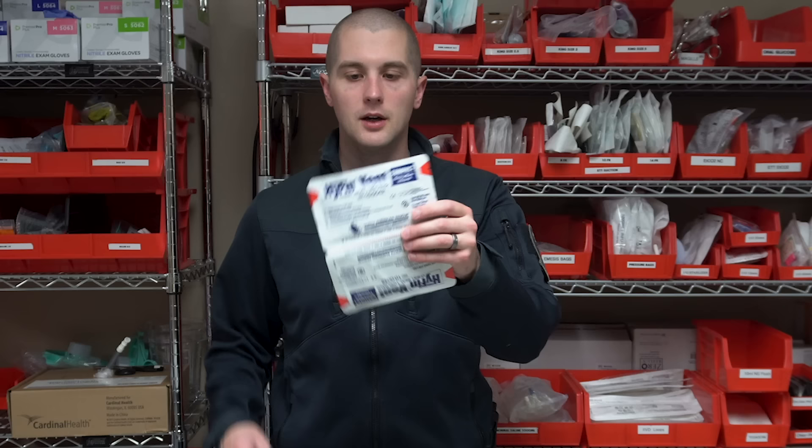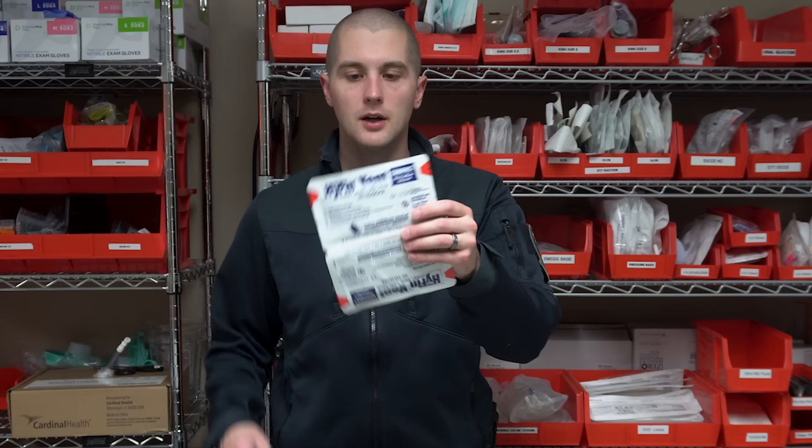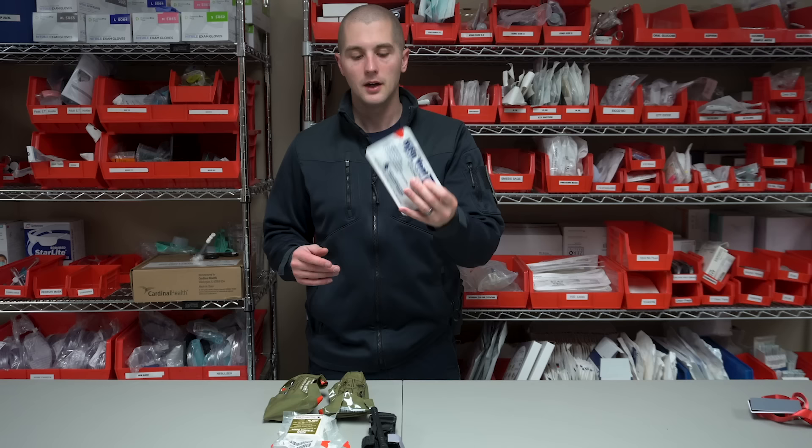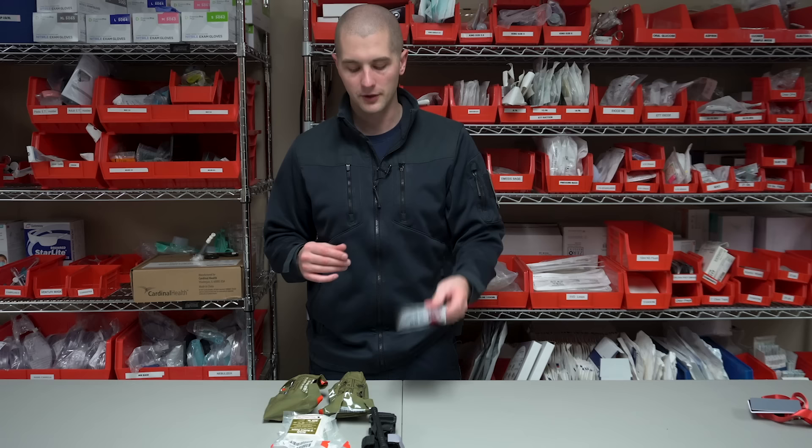The fourth thing I would have in your core is going to be chest seals. There are a lot of brands, and it's not as important to pick the right brand with chest seals as it is with tourniquets, but some brands are more reputable than others. I'm using the Hyfin compact chest seals. These both have vents in them and work pretty well. I would always recommend you have at least two chest seals for an entry wound and an exit wound on the chest.